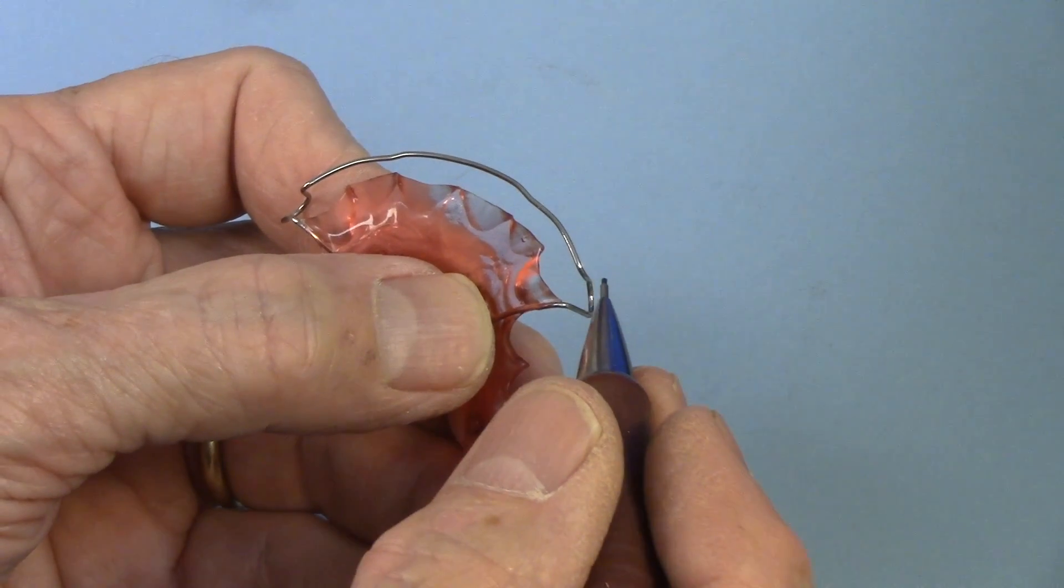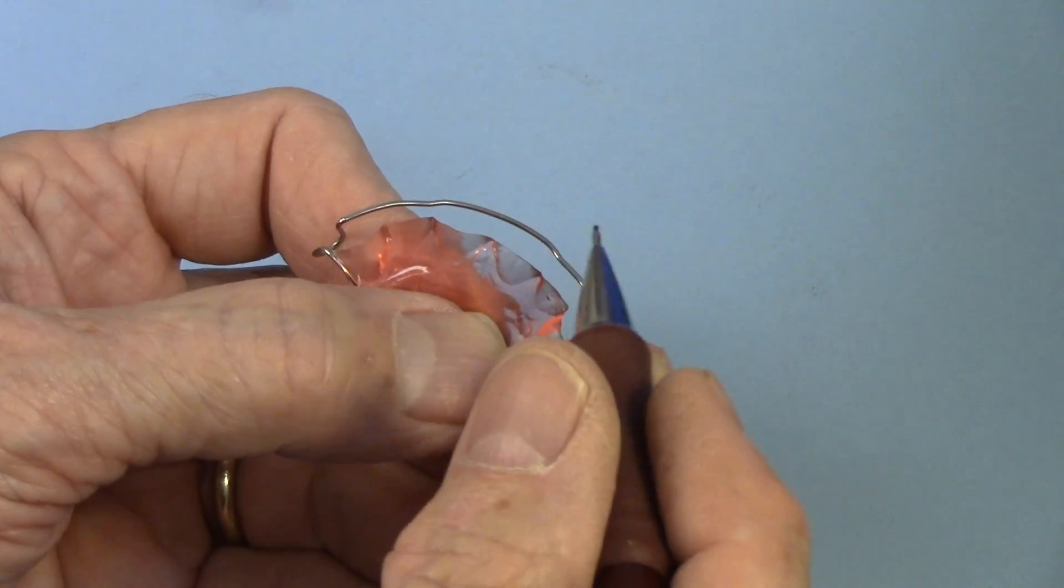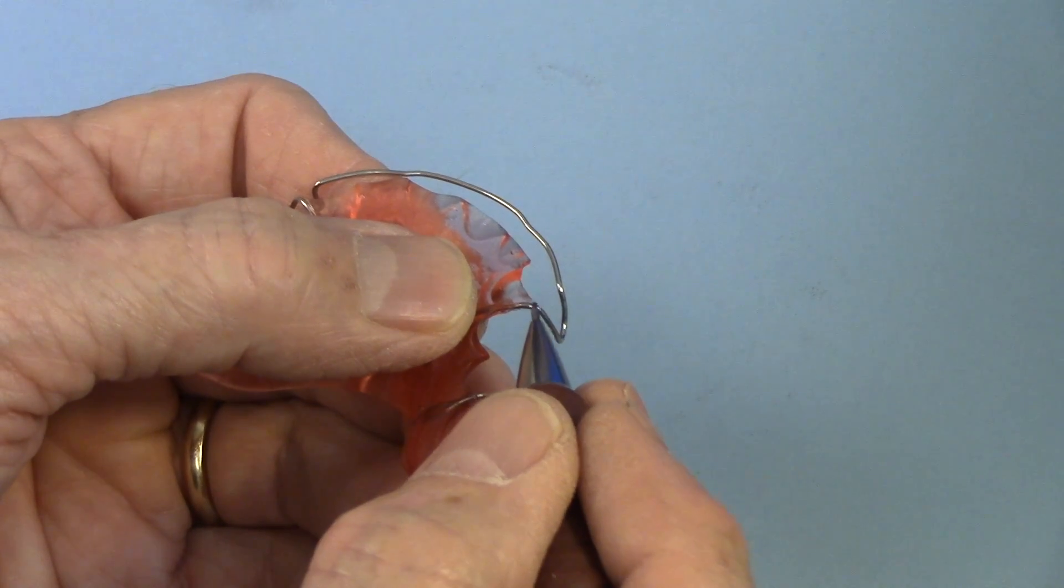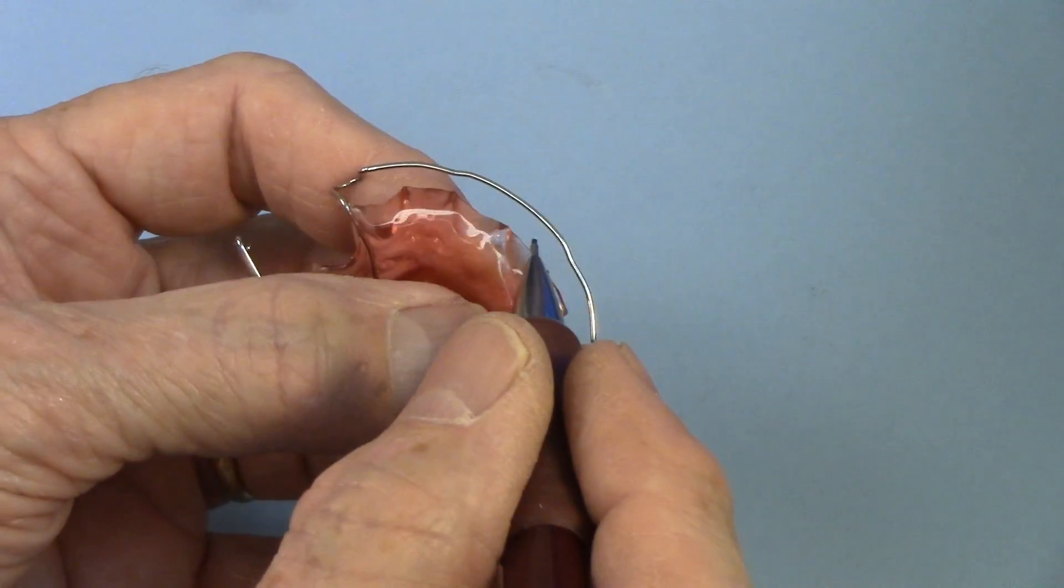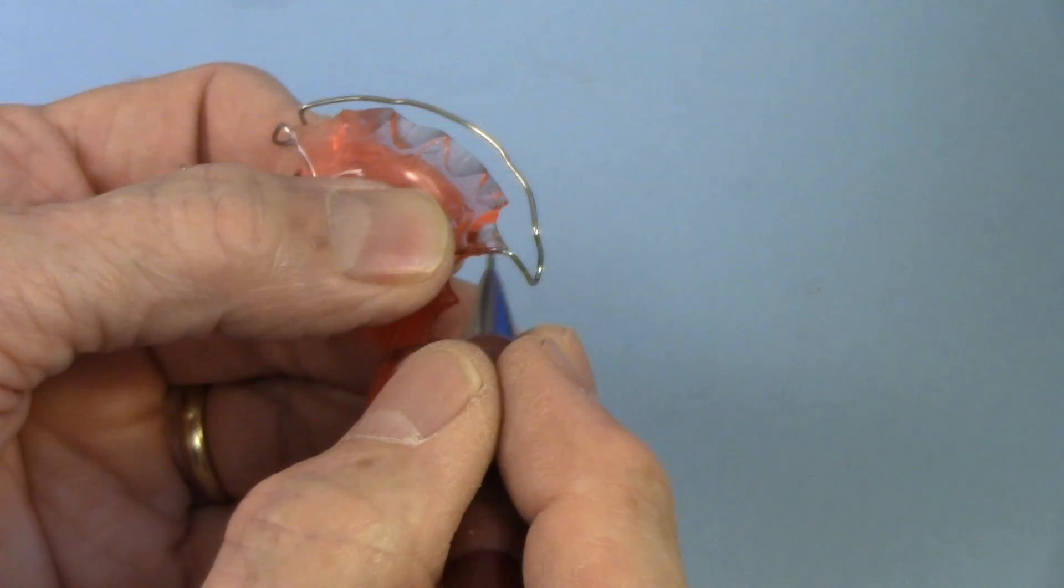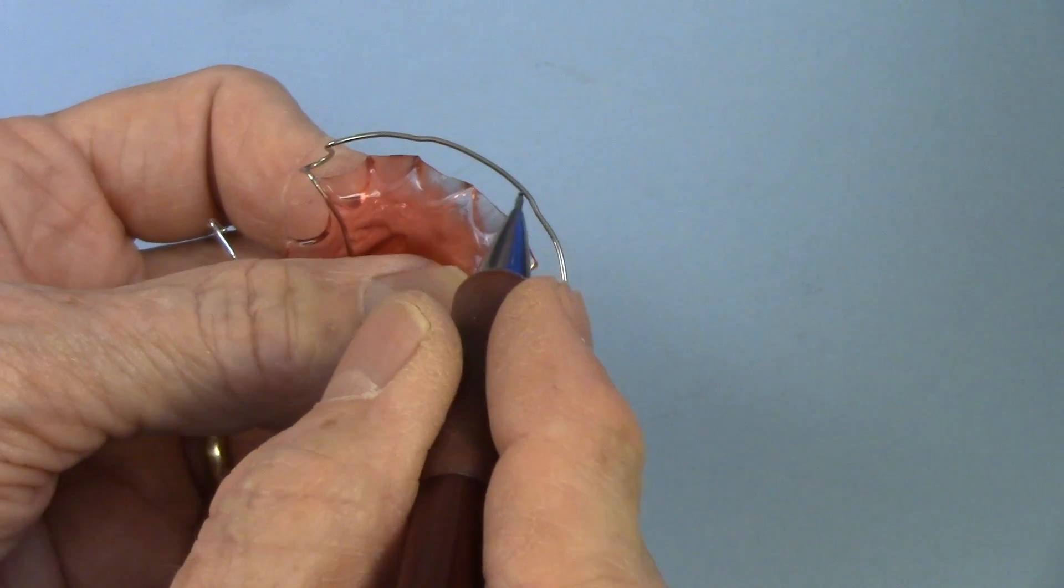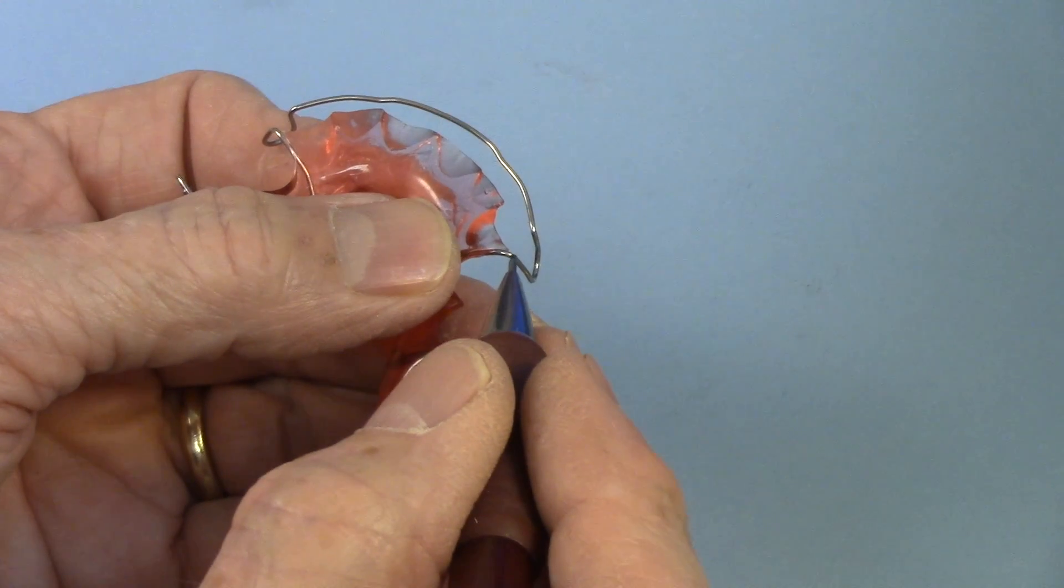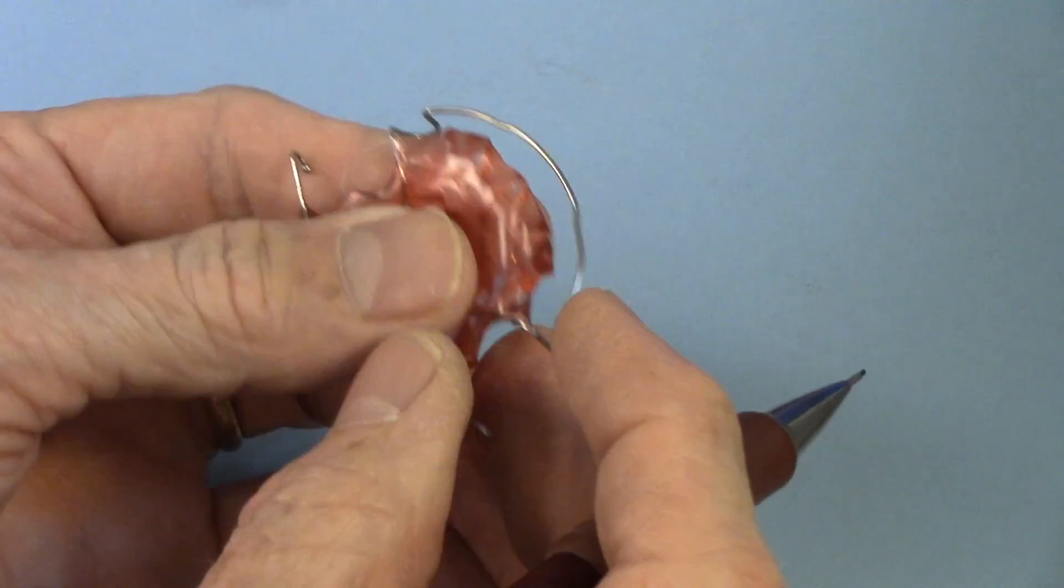But since elasticity and tensile strength are inversely proportional, that means that the more elasticity you have, the less tensile strength you'll have and the less durability you'll have. So this is the point of stress on a labial bow. If you have a springy wire, it's going to be less durable here. If you have the teeth all in alignment, then maybe you can go with the cobalt alloy wire and have it go across here and you'll be extremely durable right here because you don't need the spring right there.